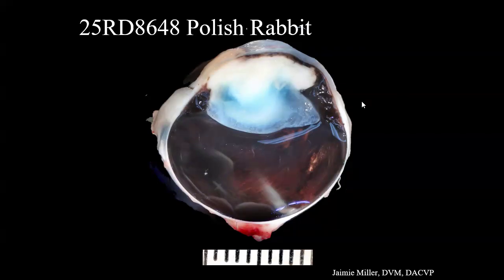So this is our hemisected view of our formalin-fixed globe. We've got the cornea oriented at the top. Here's our lens in the center, and we have the posterior portion of our eye here with the optic nerve in the back. What we can see here is some pigmented tissue that lines the posterior portion of the cornea, so presumably this is the iris tissue that is broadly adhered to the back of the cornea.